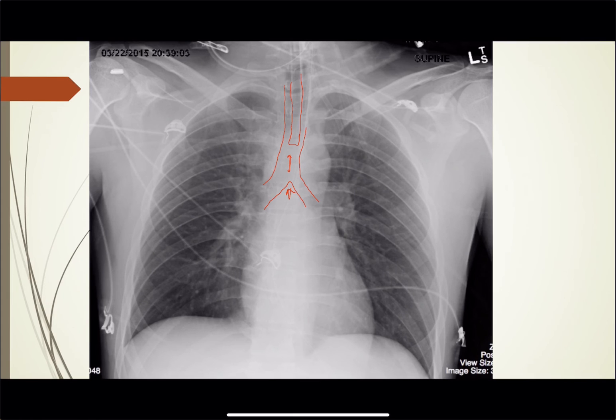Looking for anything else going on: lung markings go all the way out — that's fine. Cardiac silhouette, diaphragms look okay. Looks like there may be an NG tube coming down here — it's kind of cut off so you can't really see. In any case, we're just looking at the endotracheal tube and it's in good position right there.